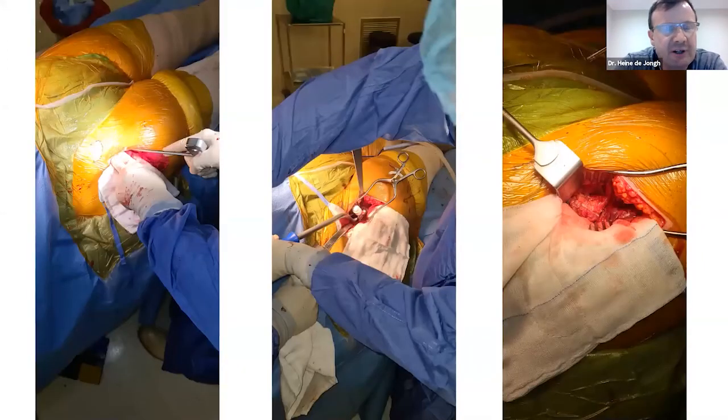Couple of tricks on the left-hand side. When you've done your trials and you want to dislocate, I've seen this trial head disappearing medially, never to be seen again. So the tip is to keep your finger on that head when you dislocate. When you do femoral impaction of the prosthesis, make sure that you keep an eye on the medial calcar for any cracks. And as both speakers alluded to, use the capsule as some form of idea of leg length when you reduce, to check for a leg length discrepancy that you created.